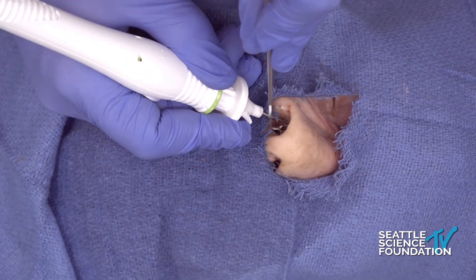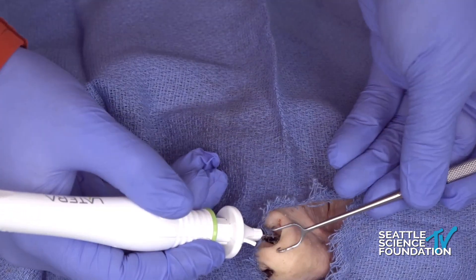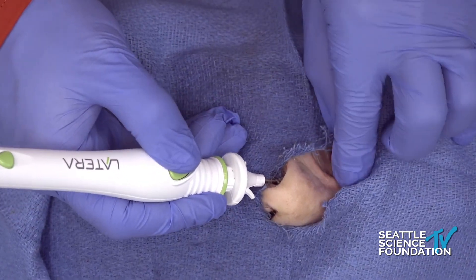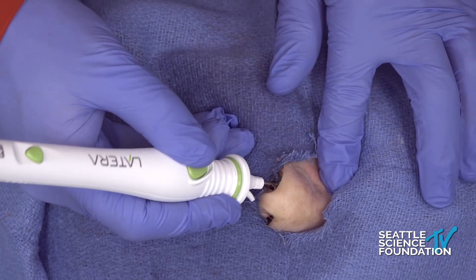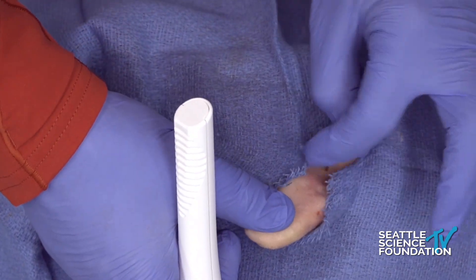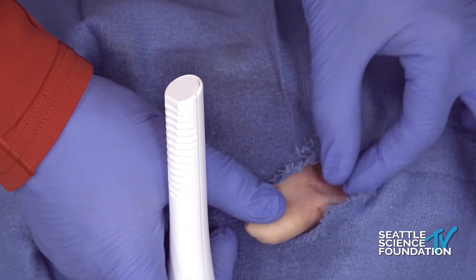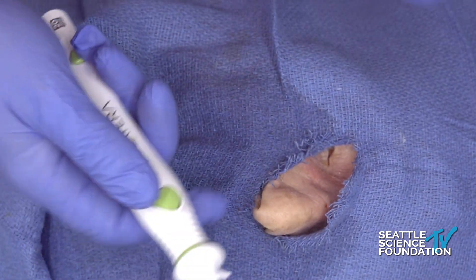There we go. Now the bevel is towards the bone. As you deploy it, you push this little thing in, it advances and clicks, then you keep your finger over the device and wiggle it out — and that's the Latera implant. If you do things right you can't see it. One risk is skin show of the implant. It does dissolve in about a year and a half.